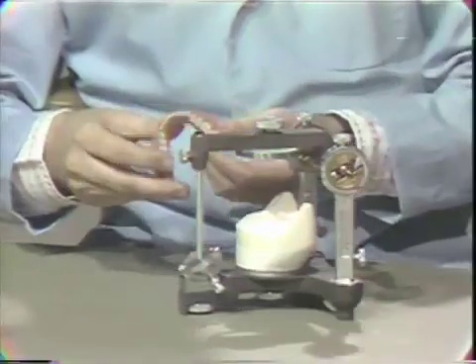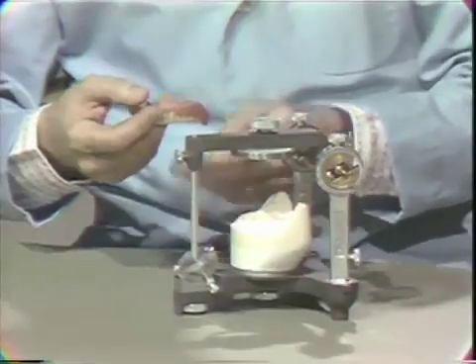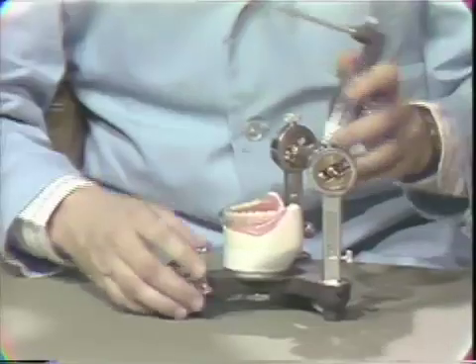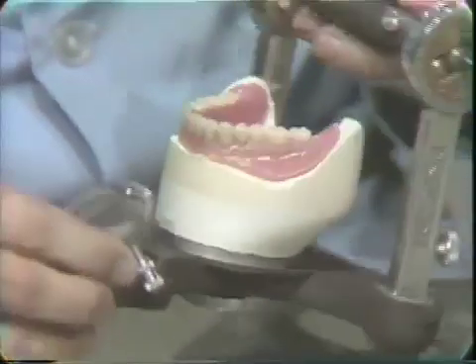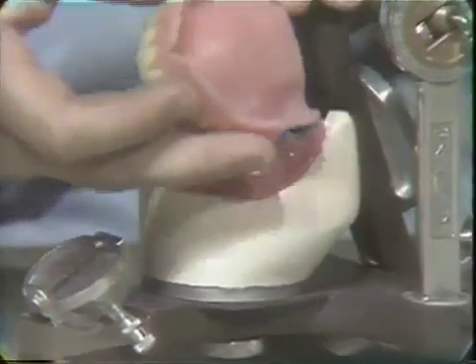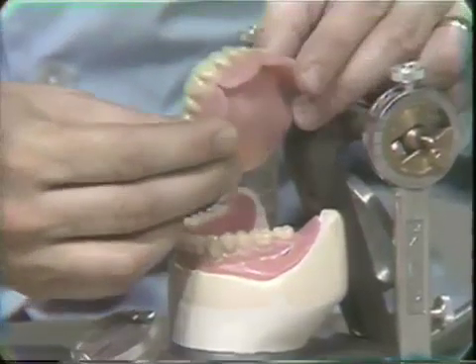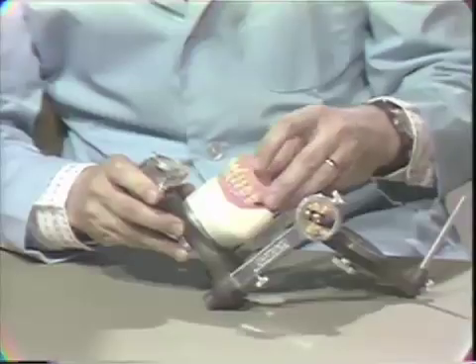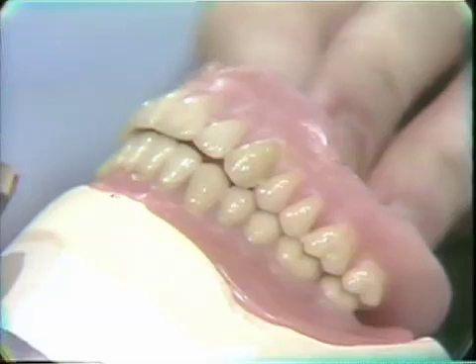Now at this time you all have a lower denture in wax. These have not been processed but they should be able to be removed from your master cast. If not, it's not necessary that it be done at this time, but we all have the lower attached to the master cast which has been mounted. This relationship has not changed yet. So for the first step, just leave the lower exactly the way it is. Now also at the same time you all have the processed maxillary denture. Now instead of making a new wax occlusal registration from the mannequin, for this course in order not to mutilate the occlusion, what I would prefer is to simply hand articulate the upper to the lower into maximum intercuspation.